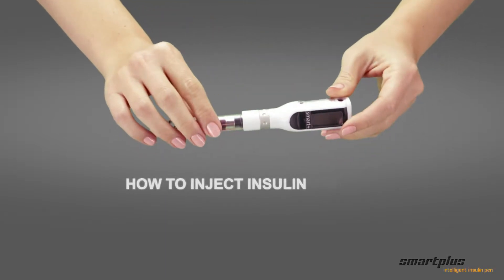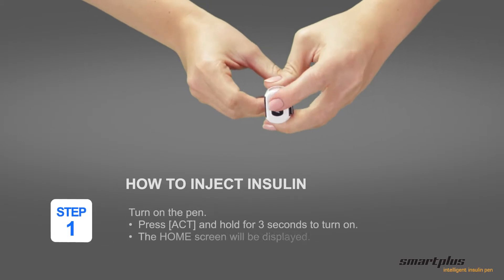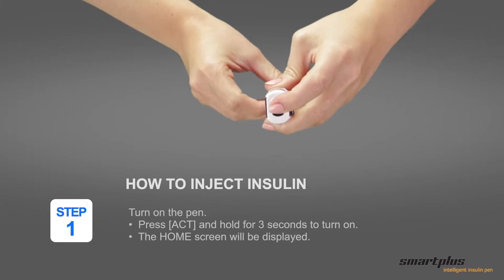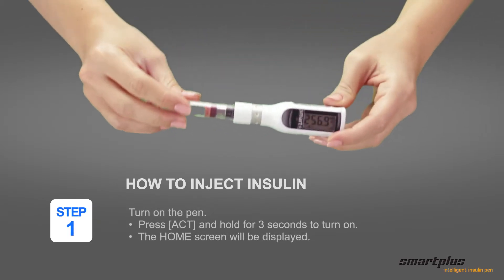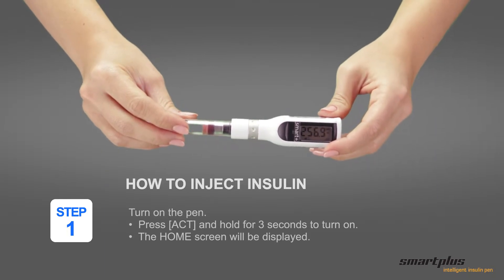How to inject insulin. Step 1: Turn on the pen. Press ACT and hold for 3 seconds to turn the power on. The remaining amount of insulin is displayed on the home screen.